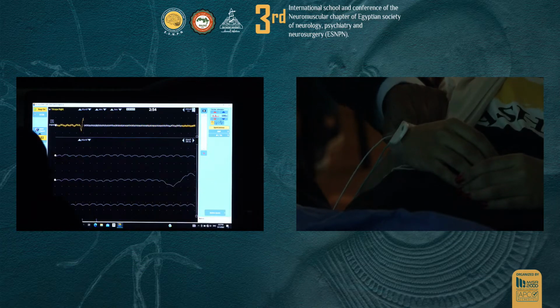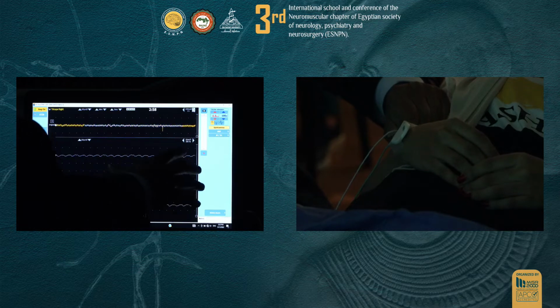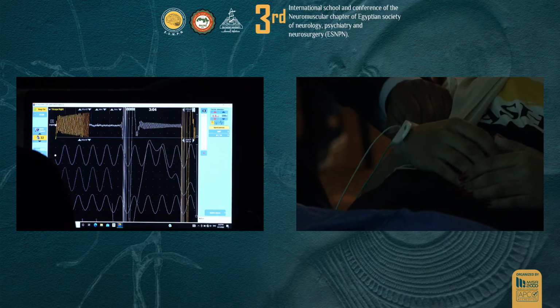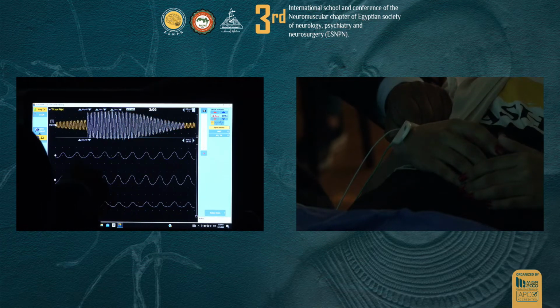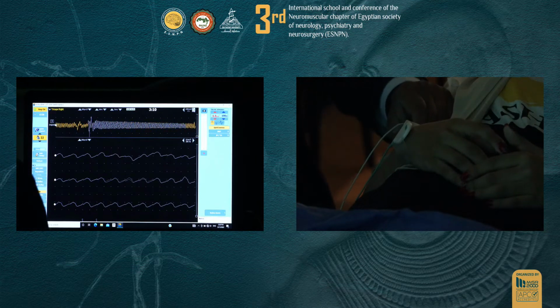Okay. Now each small square is 100 milliseconds. The whole screen has 20 divisions. So this is 100. When I move the needle, it should not fire for more than 3-4 squares. Okay, 3 to 4 squares.